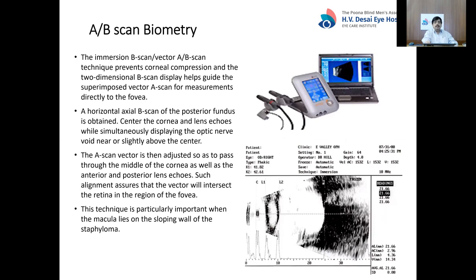A-scan can also be done with an A/B-scan machine. Immersion B-scan prevents corneal compression and the two-dimensional B-scan display helps align the A-scan vector to the fovea. A horizontal axial B-scan of the posterior fundus is obtained, showing the cornea, lens, and retina, with the optic nerve shadow just above the retinal center. This allows the A-scan vector to be directed exactly onto the fovea — very important when there is a posterior staphyloma where the macula lies on the sloping edge.